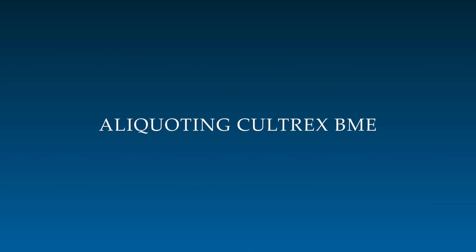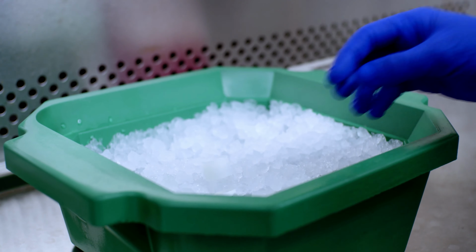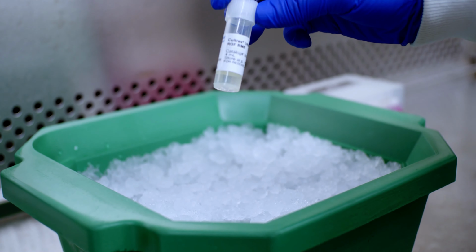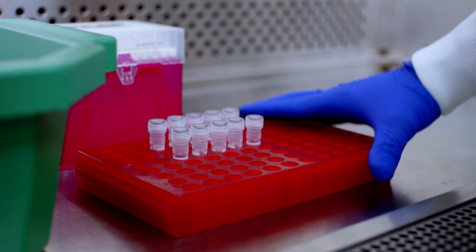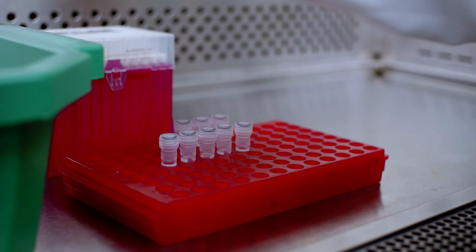Aliquoting Cultrex BME will extend the lifetime and preserve the quality of the matrix by limiting freeze-thaw cycles that compromise matrix composition and polymerization. First, place the thawed Cultrex BME submerged in ice in a cell culture hood. Fluctuations or temporary exposure of Cultrex BME to temperatures above 2 to 8 Celsius can cause changes in protein polymerization that could impact the matrix consistency or cell behavior.